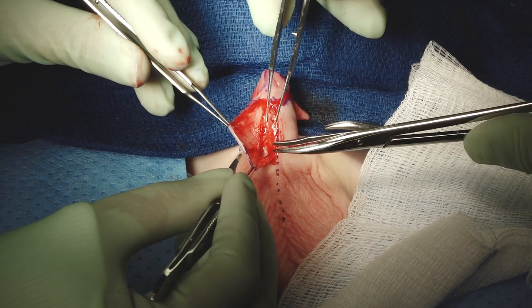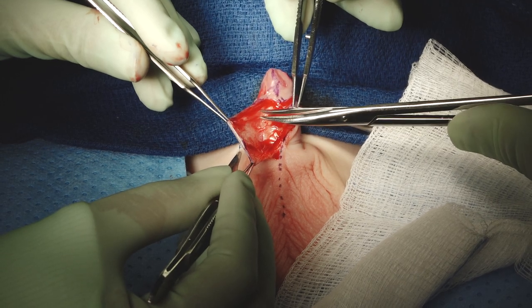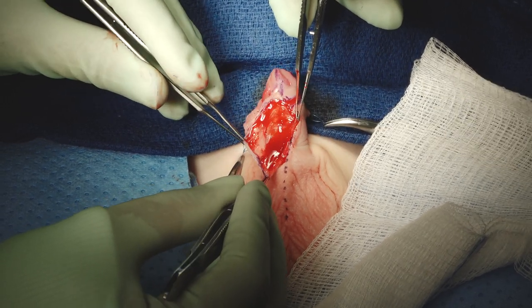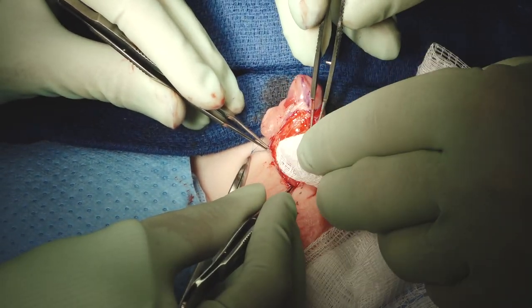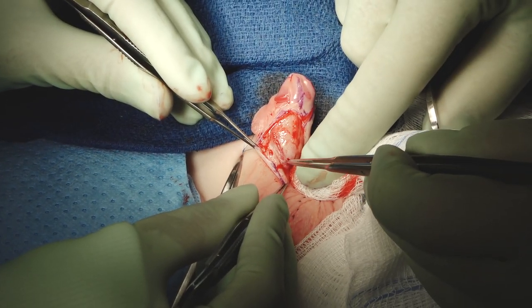You have to be really careful with this incision that you don't inadvertently injure your mucosal collar, so you want to stay really close to the skin, which also helps you preserve your dartos. It's interesting that here we are doing a distal repair through a different incision than we were used to doing, so you see things from a different perspective.